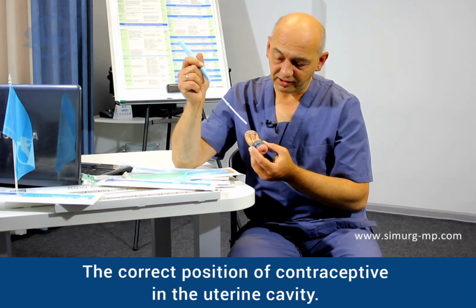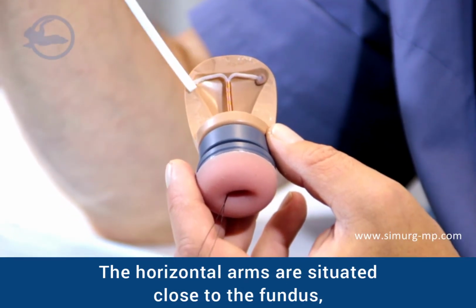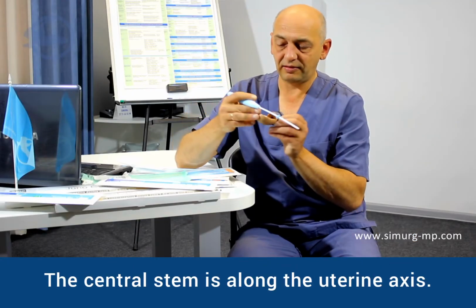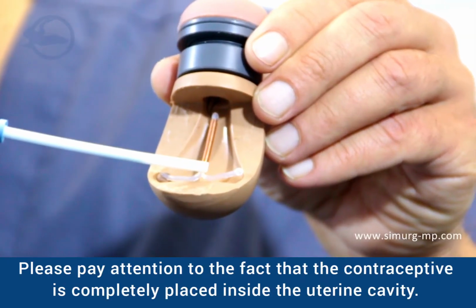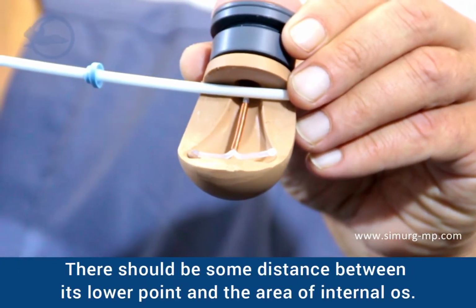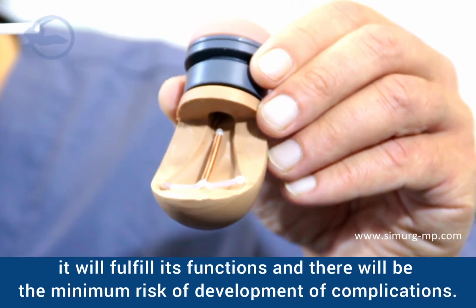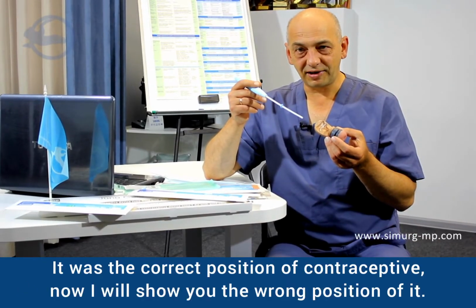The correct position of contraceptive in the uterine cavity. The horizontal arms are situated close to the fundus. Their ends, so-called olives, are situated in the area of tubal angles. The central stem is along the uterine axis. Please pay attention to the fact that the contraceptive is completely placed inside the uterine cavity. There should be some distance between its lower point and the area of internal os. It's obligatory. In case of such position of contraceptive, the IUD will be placed correctly. It will fulfill its functions, and there will be the minimum risk of development of complications. It was the correct position of contraceptive.